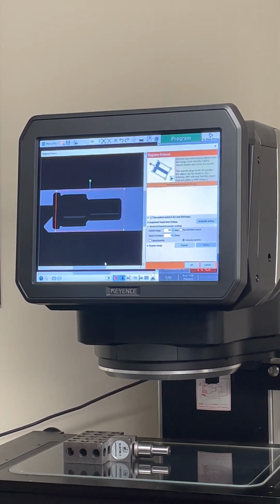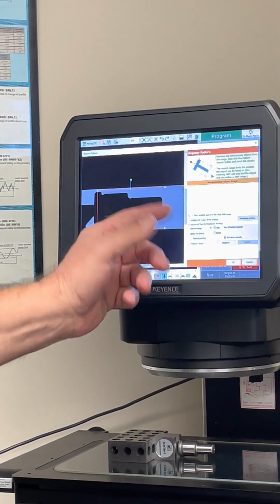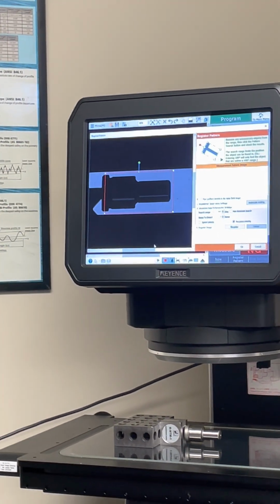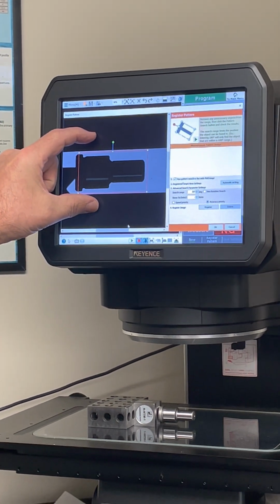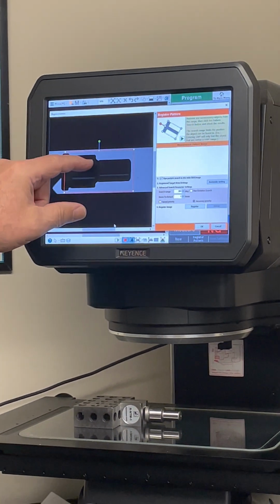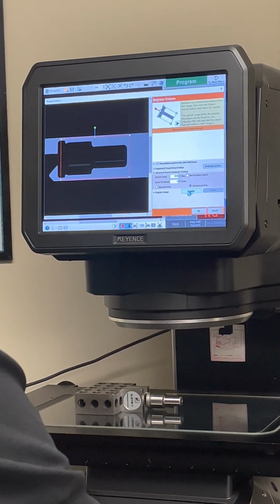It's still going to keep your length the same, all that. Now it's important to recognize, you have search range. It says 360 degrees, meaning I could actually spin that 360 degrees. But since I'm only looking at that area there, I probably wouldn't spin it at that point, but it'll fit there. And so now at this point we're going to hit register.